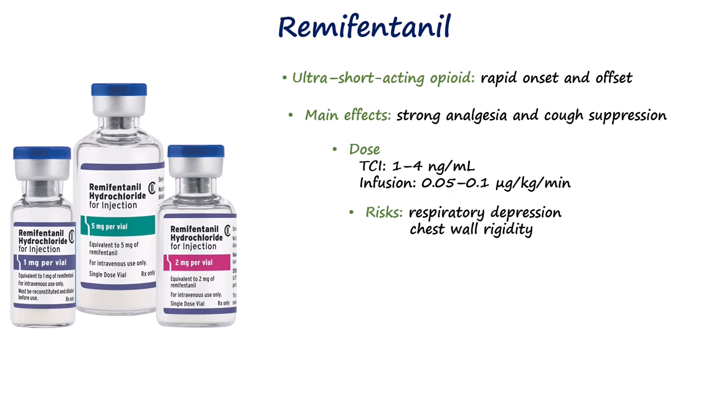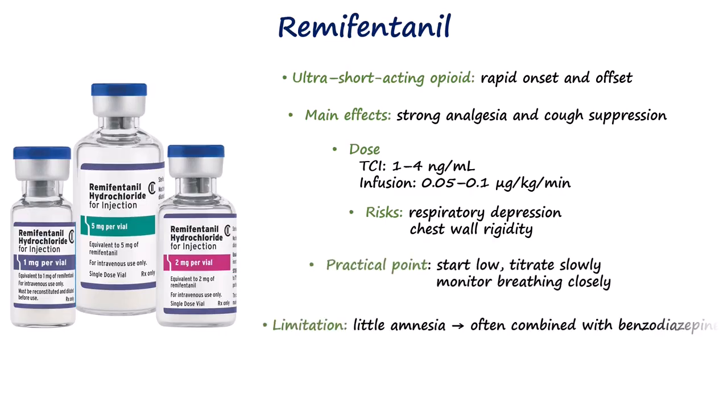Another limitation is that remifentanil doesn't provide much in the way of amnesia. Patients may still recall the procedure, which is why we often pair it with a small dose of a benzodiazepine for comfort.